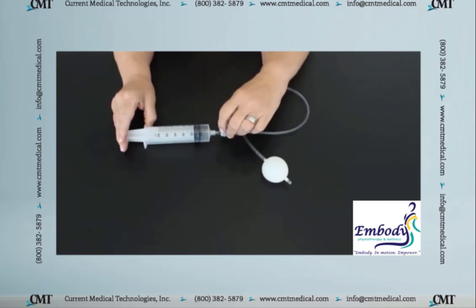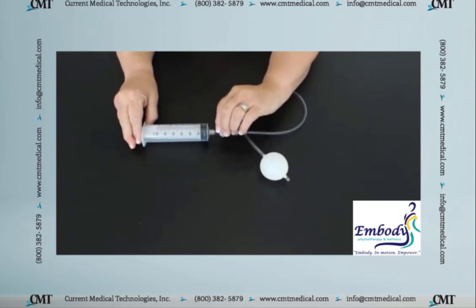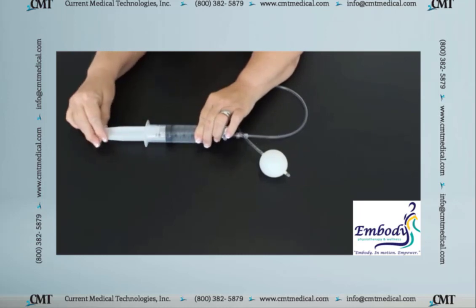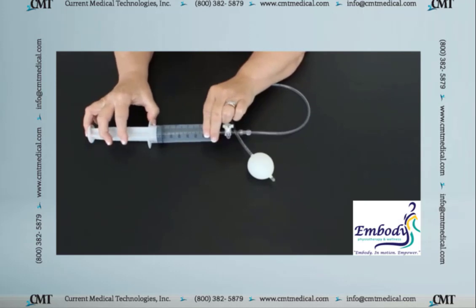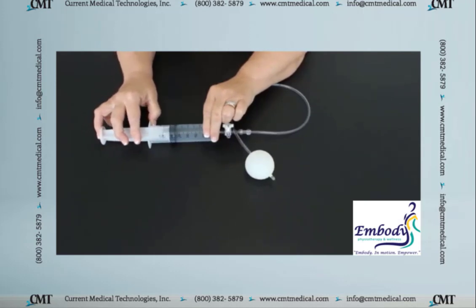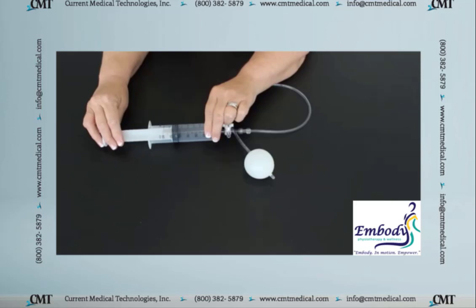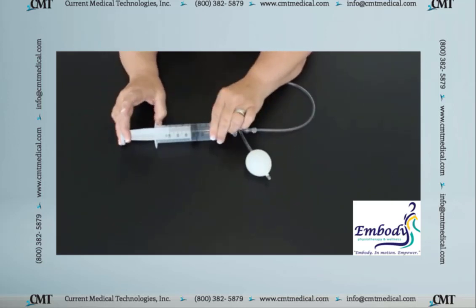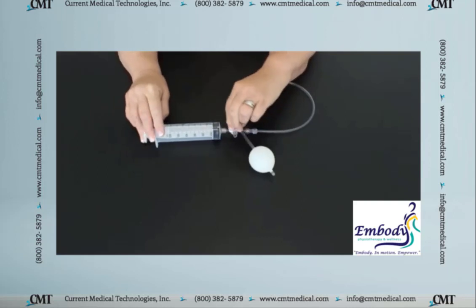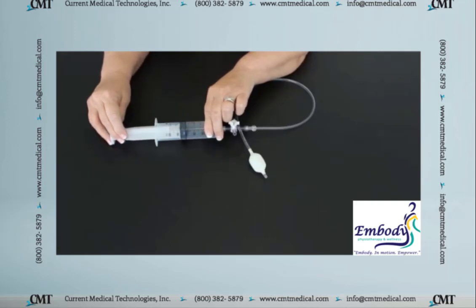Then I start to push it up to get to that big urge and they don't have it yet, so now I need to lock the balloon, pull the syringe back, unlock the balloon, and begin to fill some more. Now they say, 'I really feel like I have to go.' So you note how much air you've pushed in plus the 60, and then you start to deflate. Bring it down pretty quickly because it's more comfortable — fill the syringe up, unlock the balloon again, and then deflate the balloon completely.